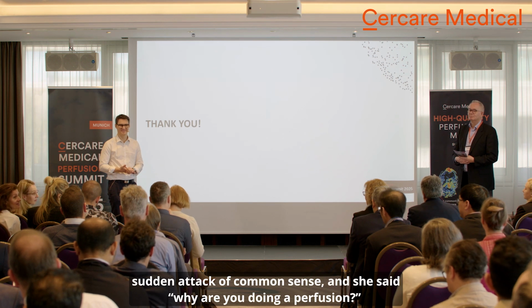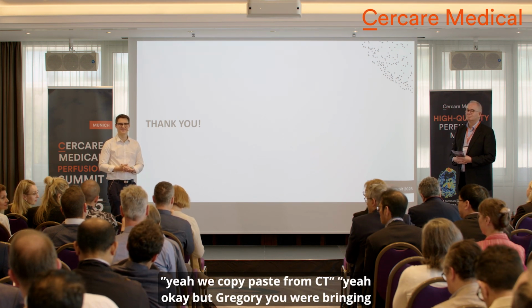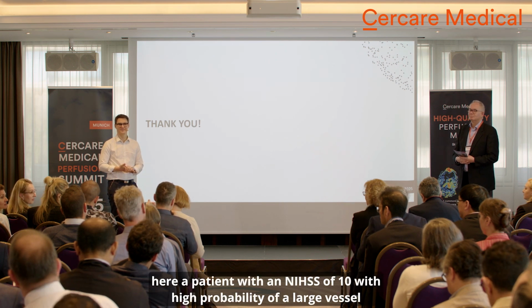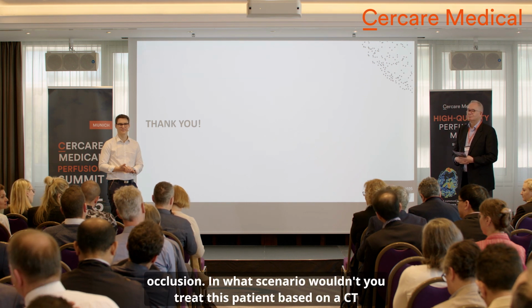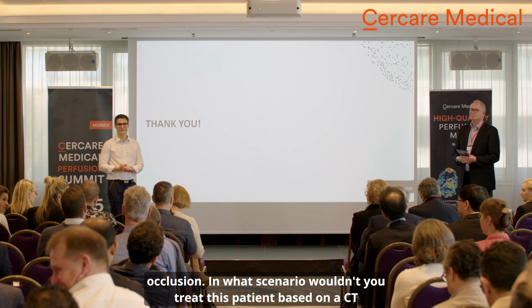at one point, one of our new fellows had a so-called very sudden attack of common sense. And she said, "Why are you doing a perfusion?" And we're like, "Yeah, we copy paste from CT." "Yeah, okay, but Gregory, you will bring here a patient with an NIHSS of 10 with high probability of a large vessel occlusion. In what scenario wouldn't you treat this patient based on a CT perfusion?"